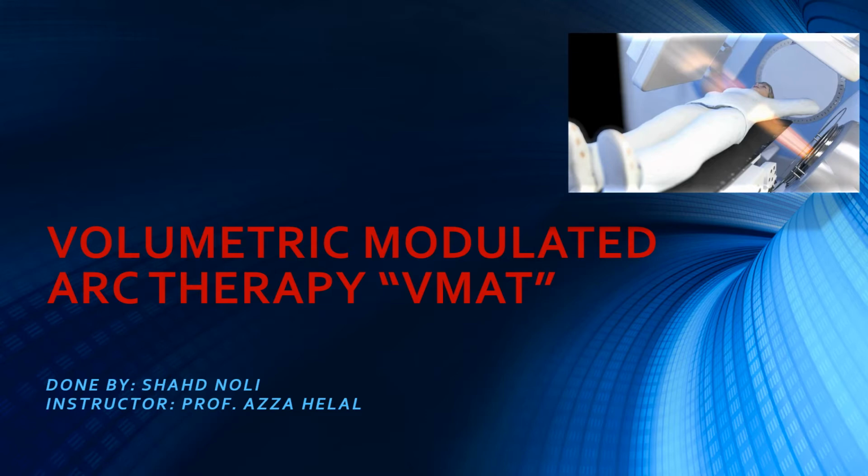Normally, in IMRT, the radiation machine usually stops in between different angles while delivering the radiation, and this is time-consuming because each procedure would most likely take around 15 to 20 minutes to do the entire therapy. But in VMAT, as we are going to see further in my presentation, the planning is done in a manner where the machine doesn't stop, but goes in the form of an arc without stopping in between so that the entire radiation delivery can be done in a short duration.